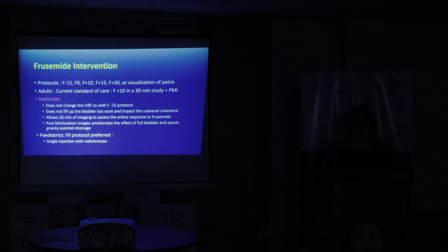In the current era, usually that is not done, because we also calculate the differential renal function at about 5 minutes into the study. Now, if we give Lasix prior to starting the study, it may change the differential renal function, and it does not really give us a technique by which we can assess the response to furosemide.